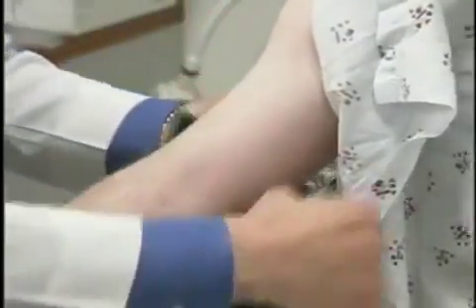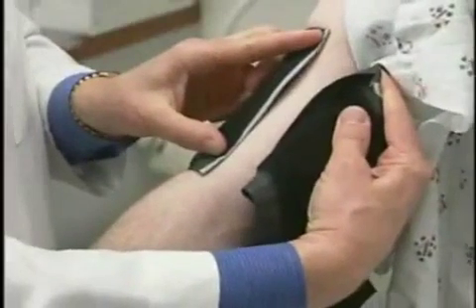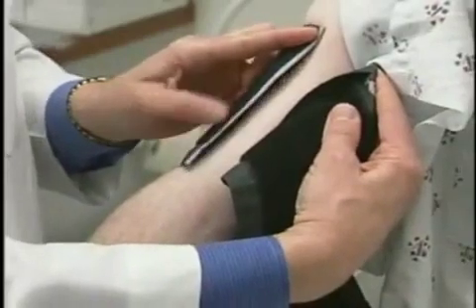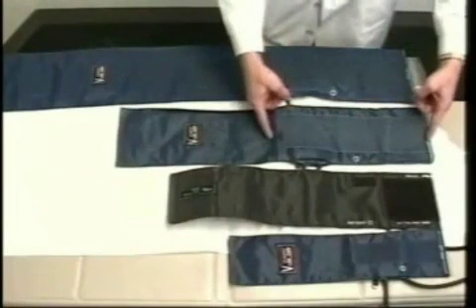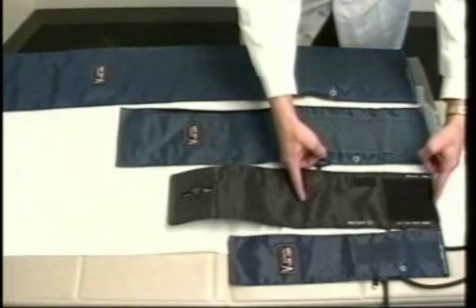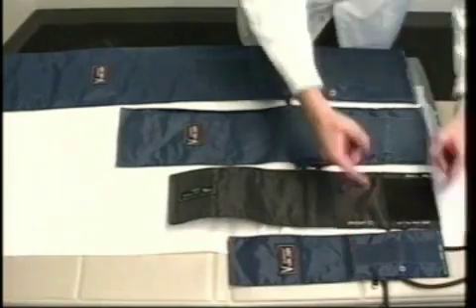Also, determining the total length of the bladder of the blood pressure cuff, which is where the tubes come out of the blood pressure cuff. When you wrap the blood pressure cuff around the patient's arm, it should approximately be at least 80% of the circumference of the arm. The length of the bladder does not represent the entire length of the blood pressure cuff. Notice where the tubes come out of the blood pressure cuff, and notice that that area is thicker. This is where the bladder of the blood pressure cuff is, and it's the length of the bladder that we're interested in, that should be 80% of the circumference of the arm to be the correct size.